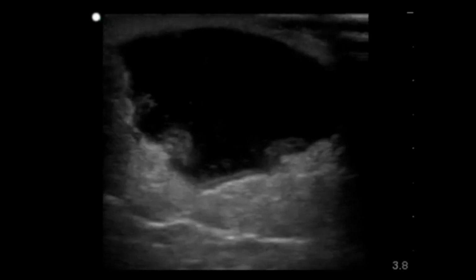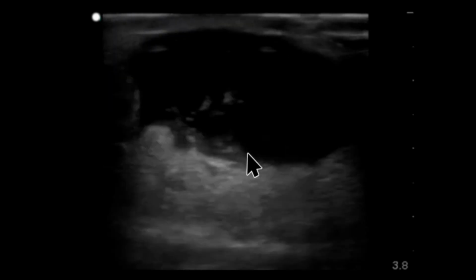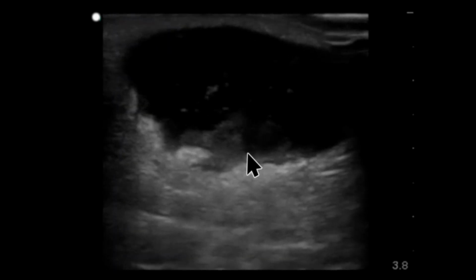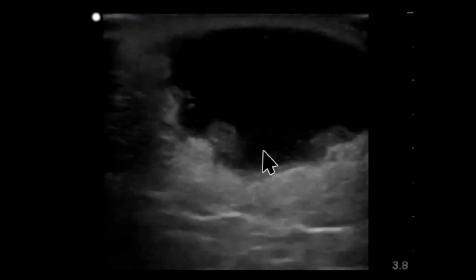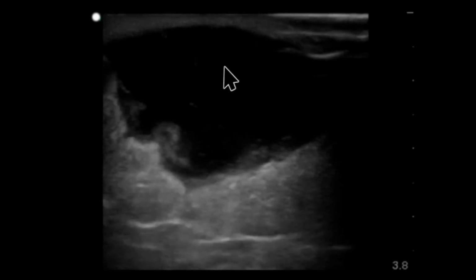Now switching to another joint, this is the olecranon, and one can see the olecranon bursitis. This condition is very common in patients. The anechoic fluid here is very superficial or close to the skin line. Here's the skin line right up here. This is where the transducer is located. It's in a transverse plane right on the edge of the elbow. The bony structures are seen posteriorly.